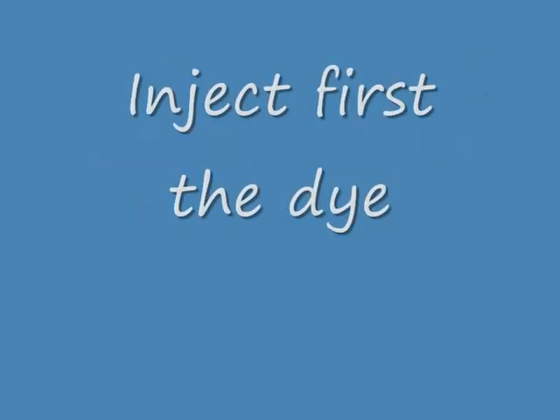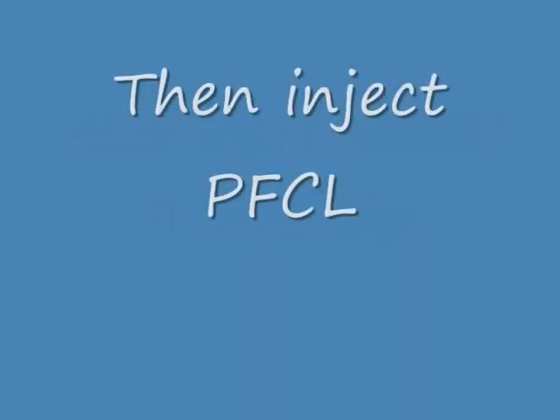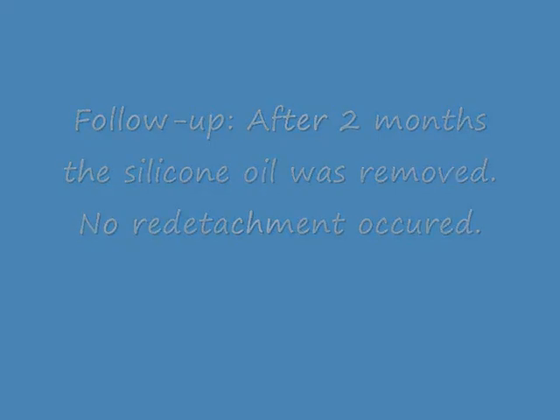To summarize the steps: inject the dye first, then try to dissect a small flap of the membrane, then inject perfluorocarbon, and start with the flap to finally remove the membrane. After two months, the silicone oil was removed and no re-detachment occurred. Thank you very much.